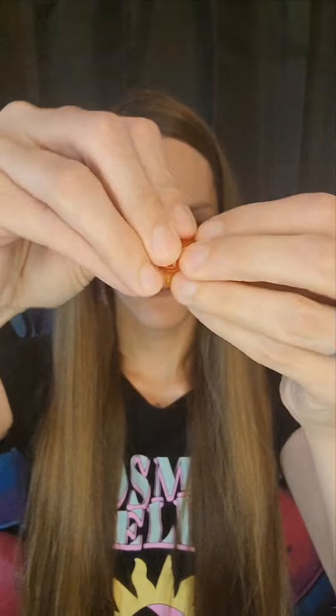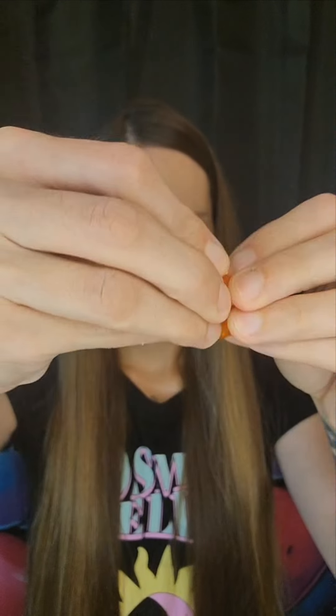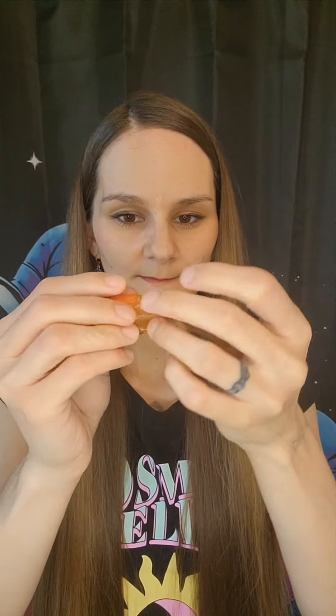So, we're going to get about that much in our hands and we are going to play with it kind of like putty to get it nice and warmed up and ready for use. Now that we have our cushion grip nice and warm, I'm going to start making it into a little pizza — a little pizza pie. That makes it easier to distribute across the top denture.